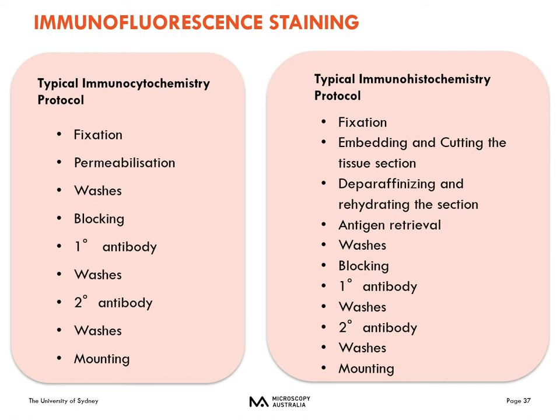Immunohistochemistry involves a little bit more steps, including extra embedding and cutting of the tissue sections, deparaffinization and rehydration, and antigen retrieval before you do the antibody staining.